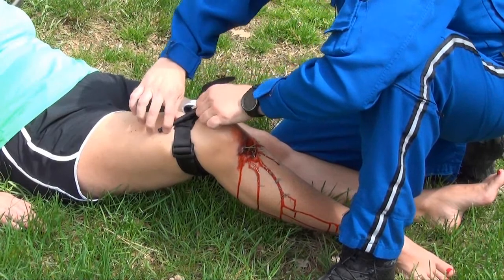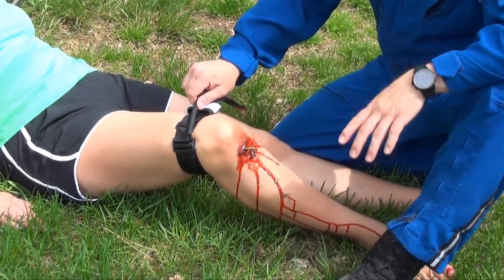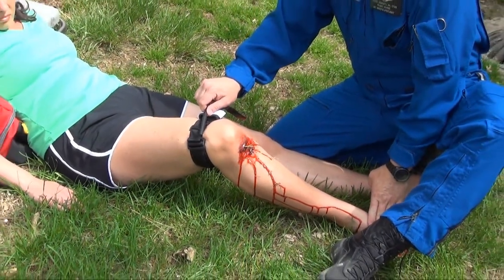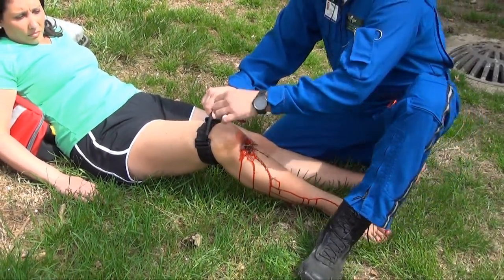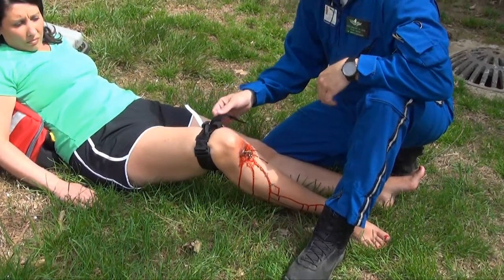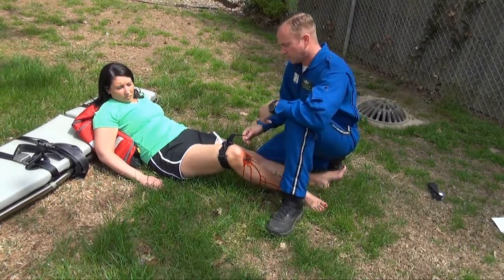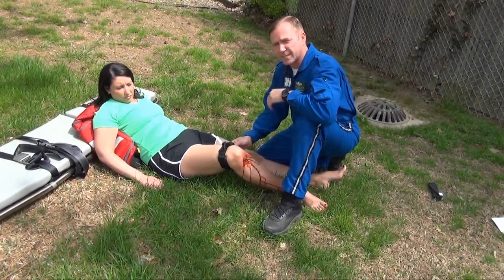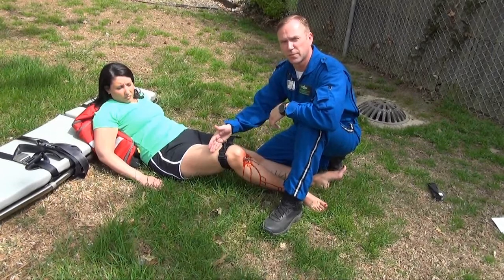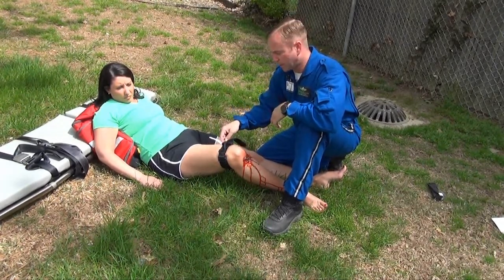Now twist the rod until the bleeding has stopped and the distal pulse has been eliminated. Then secure the rod and slide it inside the clamp. Reassess for bleeding and distal pulse. If the bleeding is not controlled, a second tourniquet can be used proximal to the first, using the same technique.